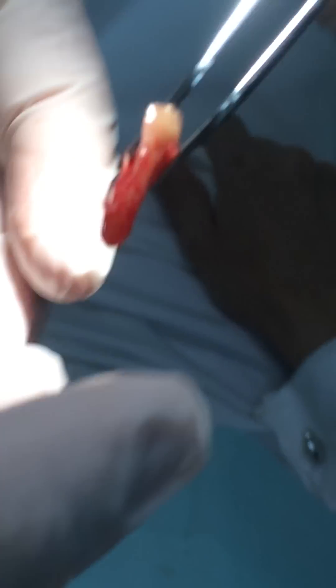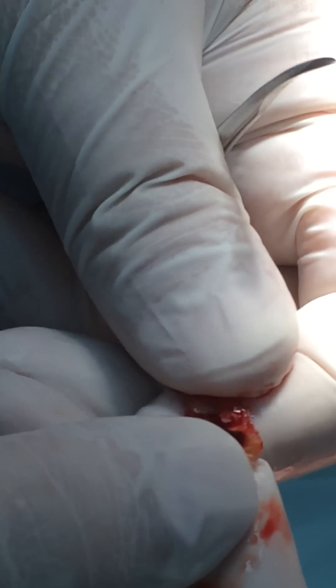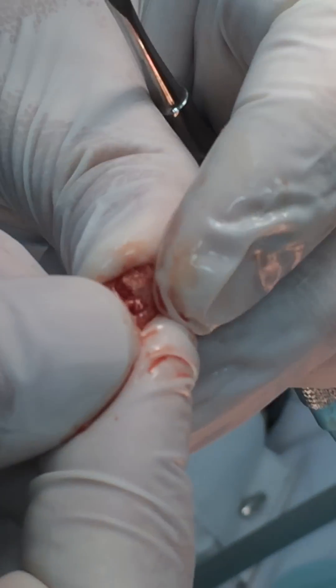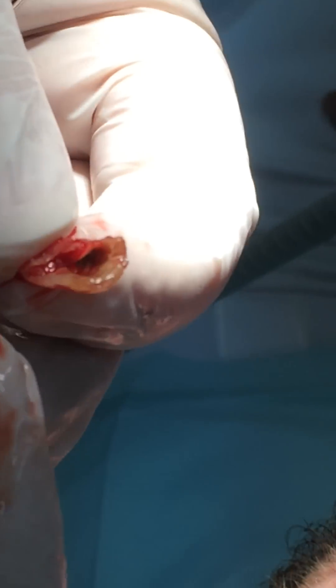Is it complete or not? Yeah, it is — that's the most important. You see, it was a good idea to separate the roots because the tooth was treated with root canal treatment. Yes, and it affected badly the bifurcation surface. You see how deep.